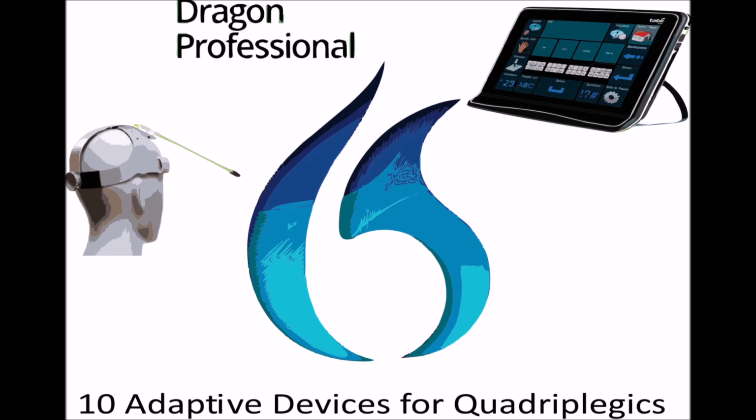6. Electric wheelchair. An electric wheelchair, also known as a power wheelchair, is a mobility device that is designed to assist individuals with limited mobility or disabilities to move around independently. Unlike manual wheelchairs, electric wheelchairs are powered by batteries and are controlled using a joystick or other control device. Electric wheelchairs are equipped with motors and gears that allow them to move forward, backward, and turn in place. They can also be customized with various features, such as adjustable seat height, tilt, and recline, to provide greater comfort and support for the user.